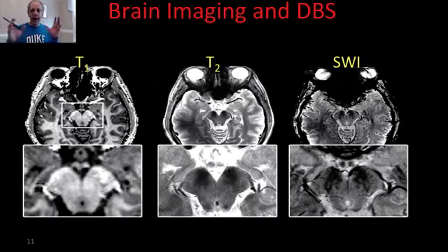Now, the way that people are looking into advancing deep brain stimulation is fascinating for image processing because it uses everything that you can get from an MR machine. Of course, this is not a class on magnetic resonance imaging, so I'm just going to name a few. We just saw diffusion imaging a few minutes ago, and we're going to see its role in a second. But people use different modalities inside the MR.